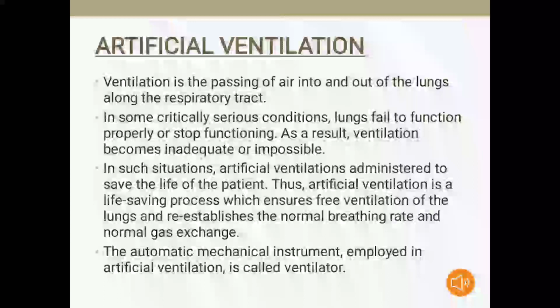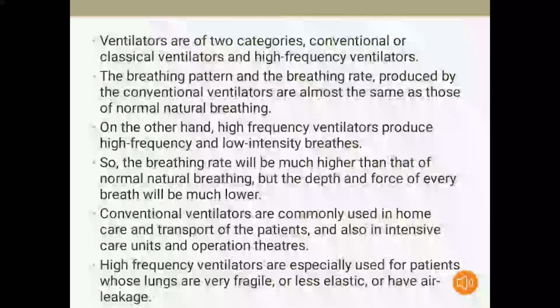It would ensure free ventilation of the lungs and it would re-establish the normal breathing rate and normal gas exchange. And the instrument used for artificial ventilation is known as a ventilator. Ventilators are of two types. First one is conventional or classical ventilators and second one is high frequency ventilators.